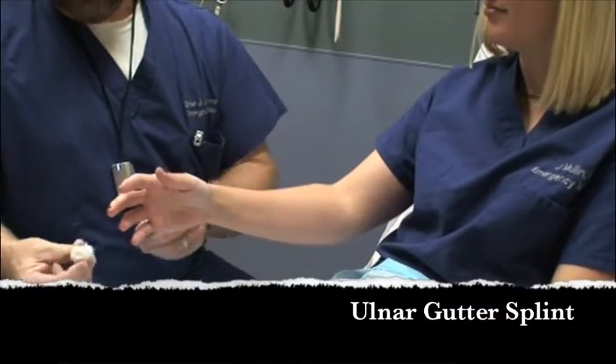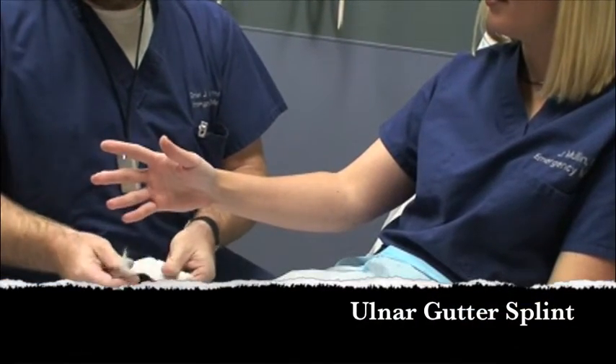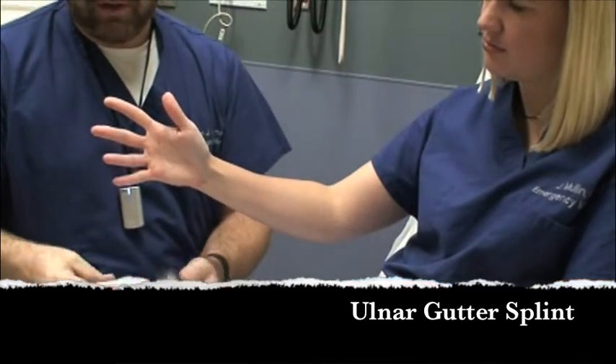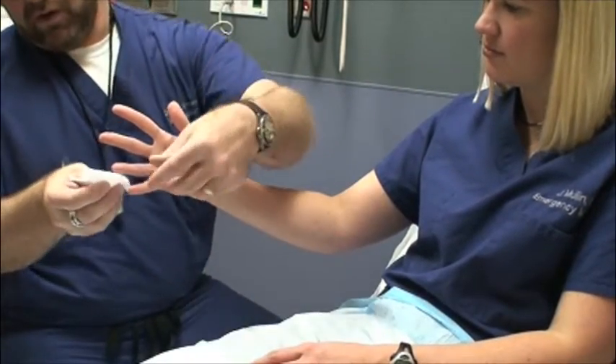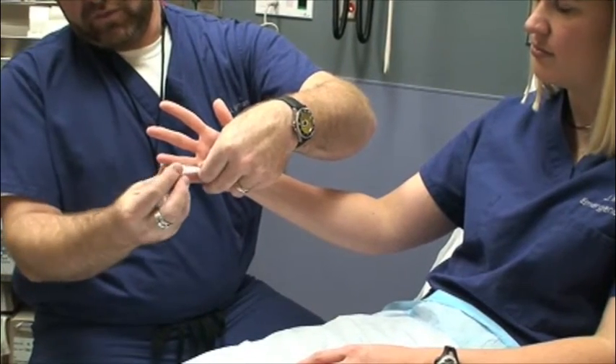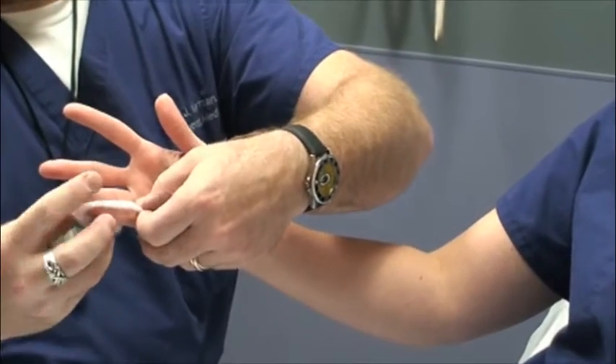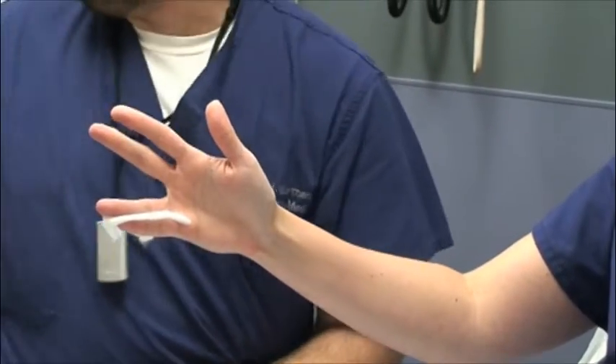This is an ulnar gutter. One of the things we want to remember to do is put a little padding between the fingers that are going to be stuck together. You can use a short piece of web roll, or you could use some 2x2s or 4x4s if you have them, just to help absorb the sweat.